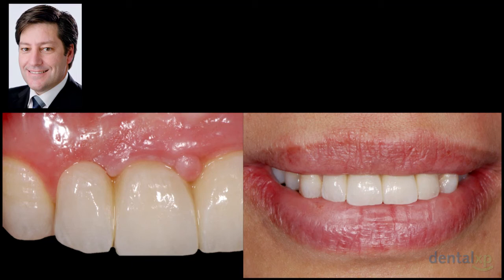If you do not perform this interproximal staining, in my opinion, what you will get in there is the piano keyboard effect, right? Where all the teeth look white on the surface and white in depth, and depending on the light reflection, sometimes that is not so natural. You see, this is very minimal.